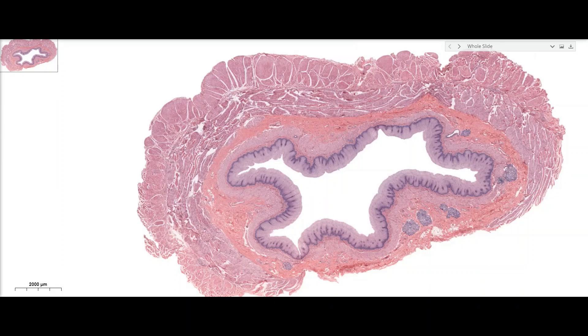Hello and welcome to Anatomy with Dr. P. In today's lesson, we'll be exploring the histology of the gastrointestinal tract. The first organ we'll be discussing is the esophagus.